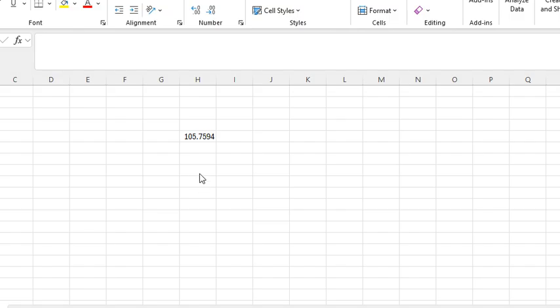I'm going to go ahead and plug this in. Now we come to here, and this is our convex, and this is our concave. We are calculating our radius of curvature, which is a little r. Now we are going to do the same thing as before.